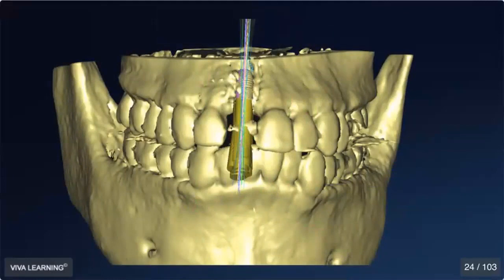Let's think about planning from CBCT only. This is a study we're conducting right now that we hope to be finishing and publishing relatively soon. What we've done is we've taken a large number of implant practitioners, most of which are familiar with digital implant design and planning. And we've had them virtually place implants under a variety of different clinical scenarios.